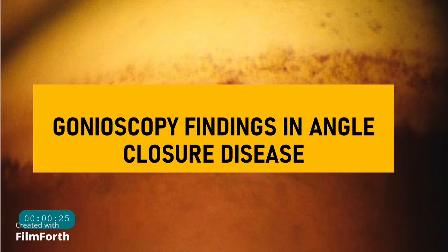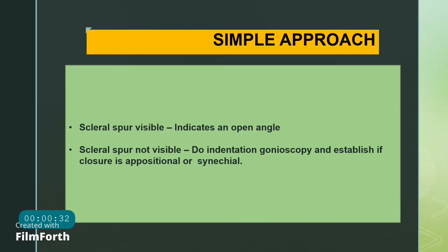Today we are studying the important gonioscopic features in angle closure disease. So without any delay, let's get started.